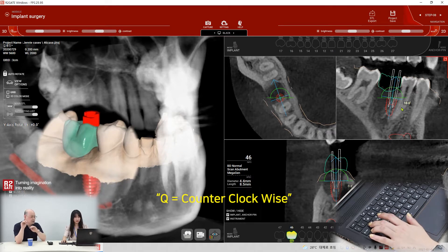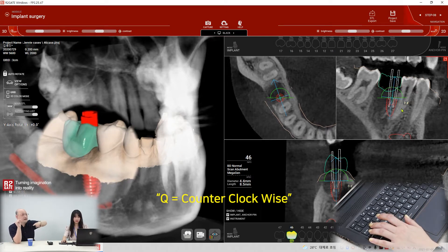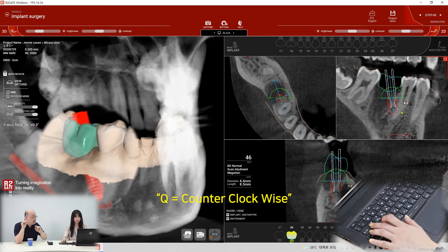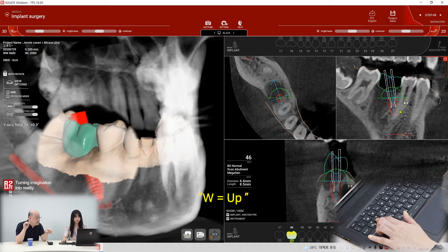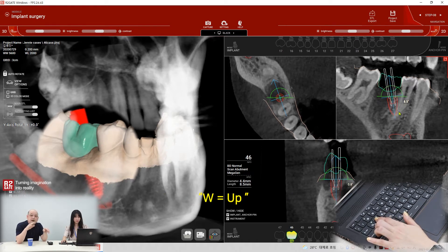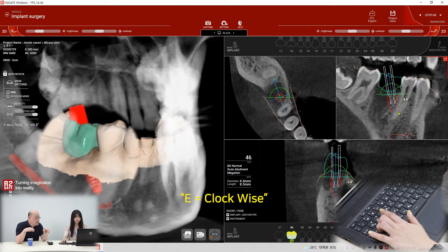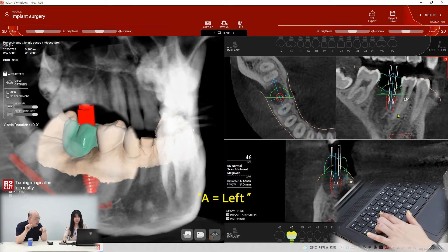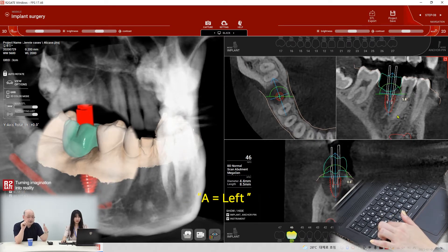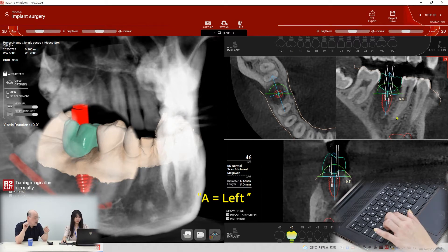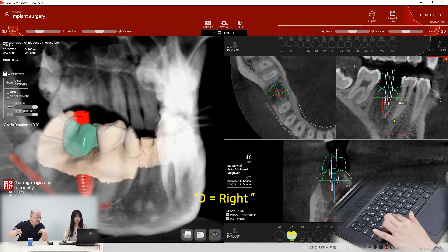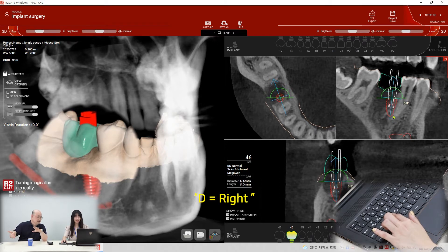Q means rotation to the left side — it's anti-clockwise rotation. W is to go up. E is to rotate clockwise. A moves to the left. S is downward. D is to move to the right.